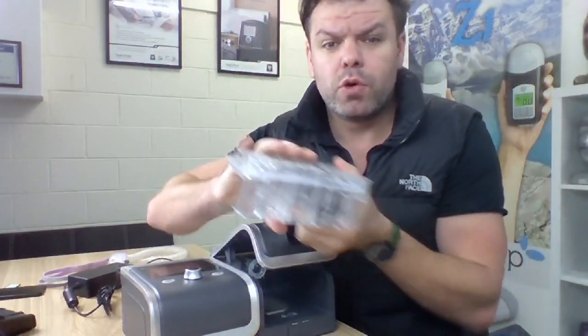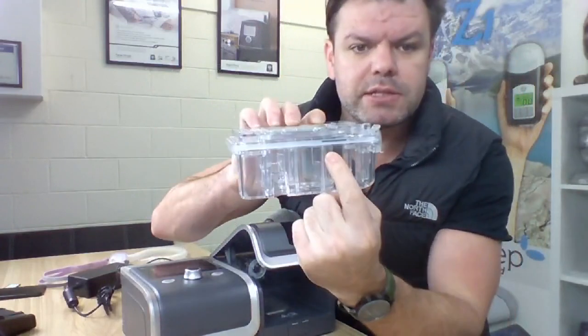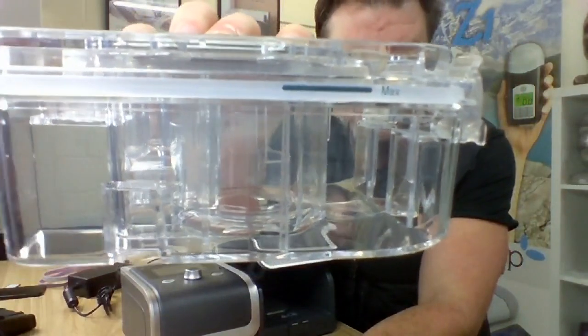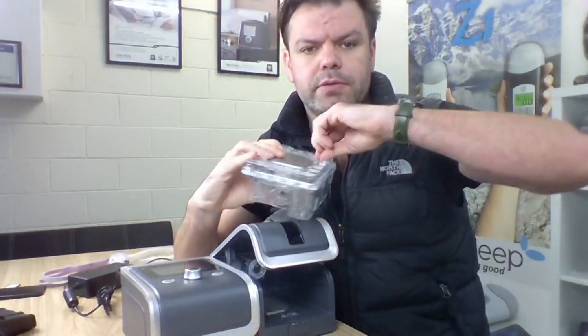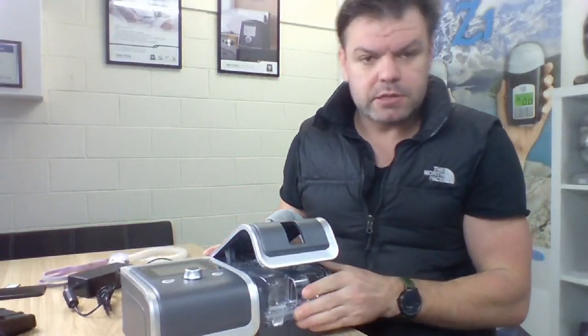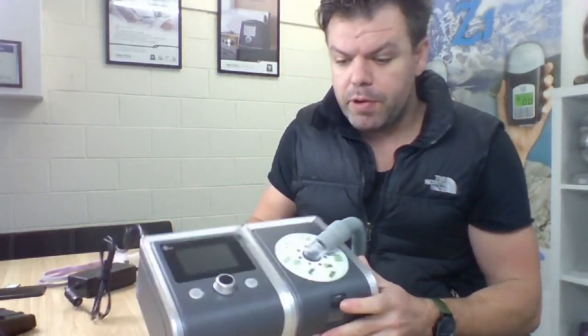Just get yourself some distilled water from the supermarket, and fill it up just below the max level. There's a little level on the side that says max, so make sure you don't go over it. A couple of mil below the max is fine. Then put your little cap back on, tighten it up, flip it back over, and place it back in. Once that's in, we're pretty much ready to go.